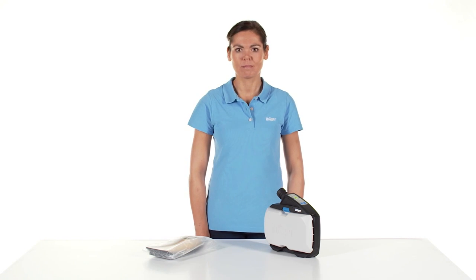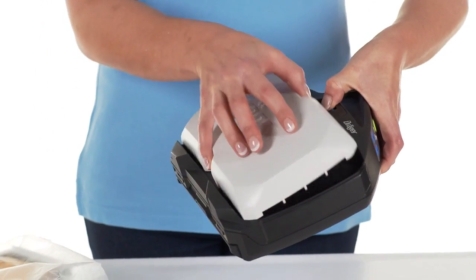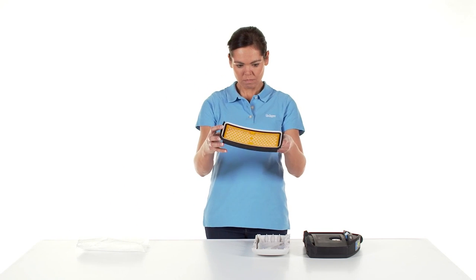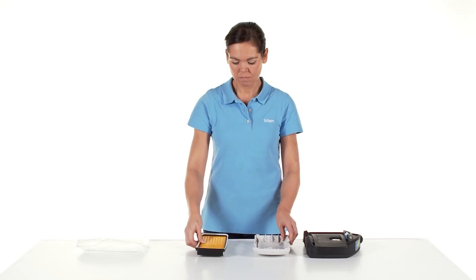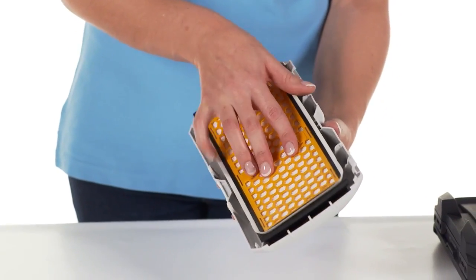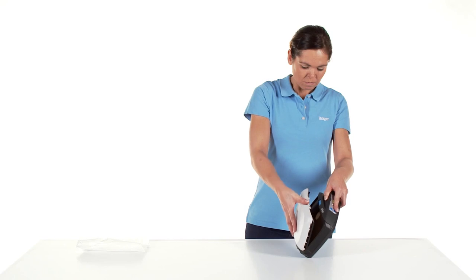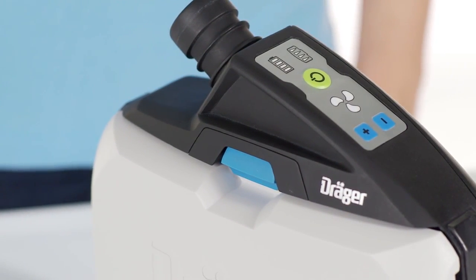To insert a filter, first remove the splash guard from the unit by pressing the blue filter locking button. Remove the filter from its packaging and check the rubber seal for damage. When inserting a particle filter, place it into the splash guard lid and insert both at an angle into the unit. Fold the splash guard lid with the filter towards the device until the lid audibly clicks into place.